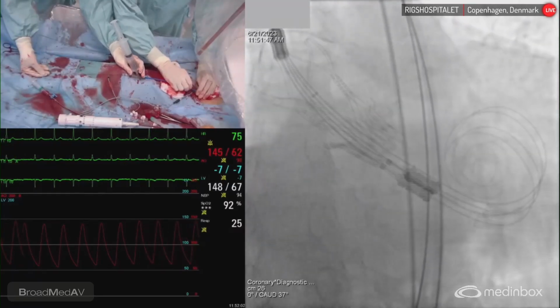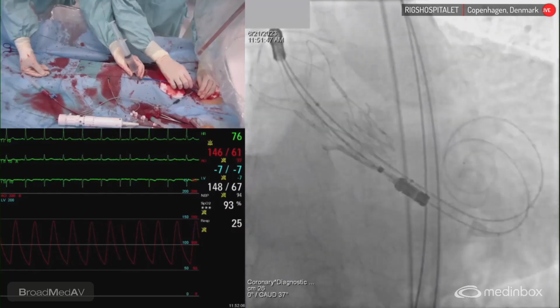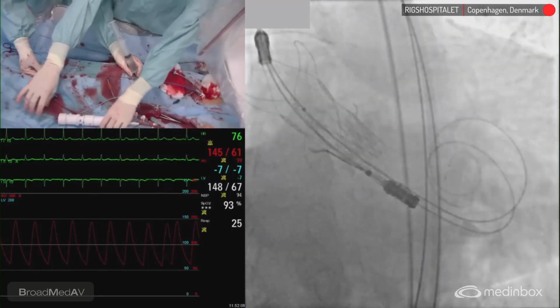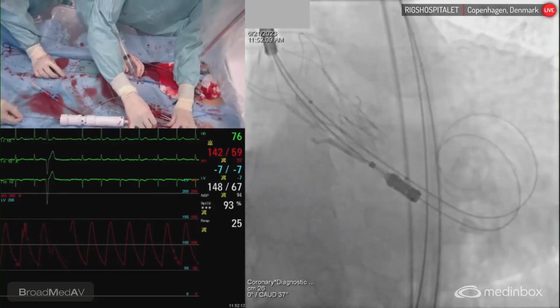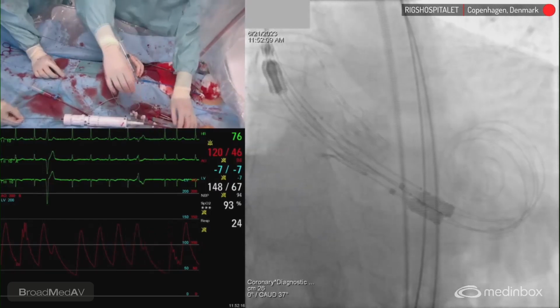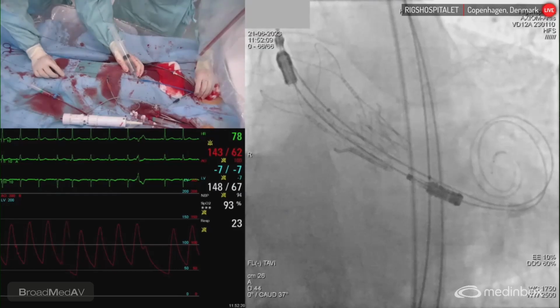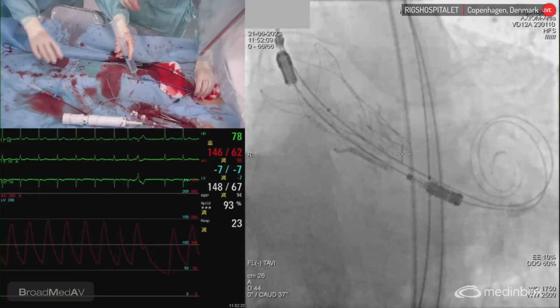I'm going to position it officially good, to the mid of the post, like there. Yeah, all right. Now I'm going to push this a bit deeper. Can somebody hold this here? I'm going to push this so it's as much as possible out of my way without perforating the LV. Yeah, okay, I think it's fine. Good. We're in good position now. Ready here? Okay, good guys.